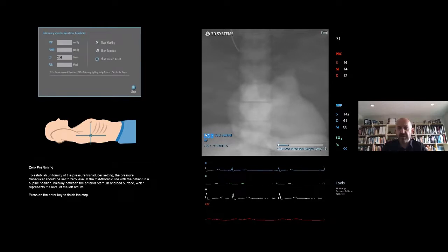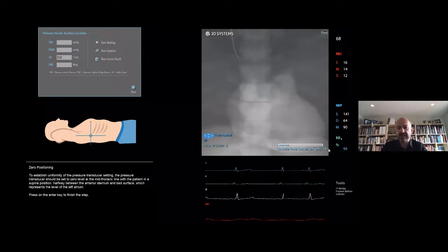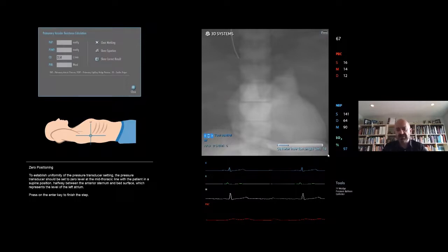And you would do this with the balloon down. If you can stop for a second, if you look at the module, you'll see that you have a distance, and it says about 14 centimeters. And this is about right. On your PA catheter, you cross the first black line. You still see the two other black lines, so you're somewhere in between. The sheaths in the neck are usually about 10 centimeters, and they usually go.